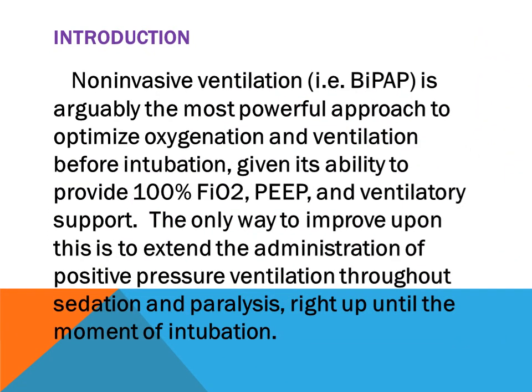Introduction. Non-invasive ventilation, described as BiPAP, where BiPAP is actually the trade name, as the name suggests, provides differing airway pressure depending on inspiration and expiration. The inspiratory positive airway pressure, that is IPAP, is higher than the expiratory positive airway pressure, that is EPAP, and therefore ventilation is provided mainly by IPAP.